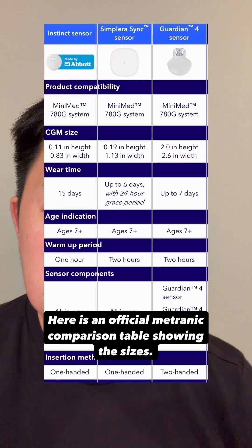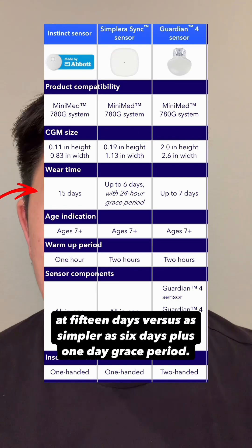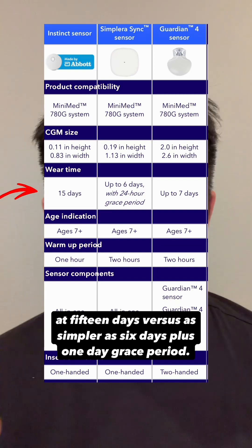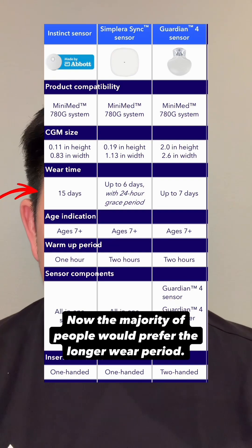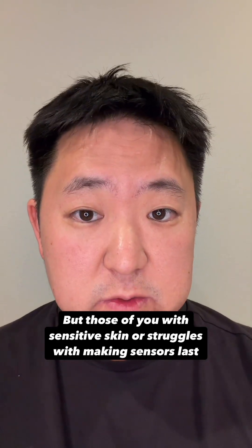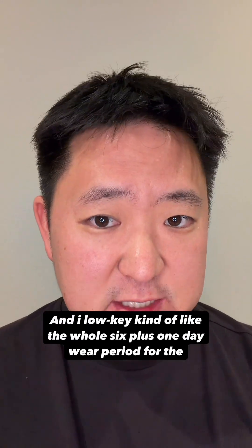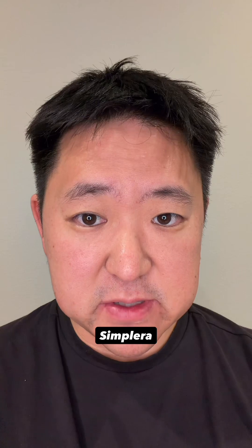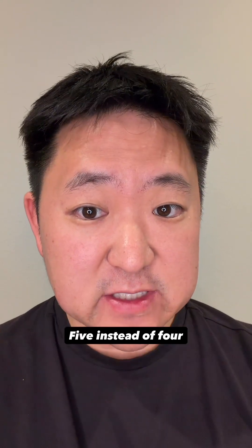Here is an official Medtronic comparison table showing the sizes. It also shows that the wear time for the Instinct is quite a bit longer at 15 days versus the Simplera's 6 days plus 1 day grace period. The majority of people would prefer the longer wear period, but those with sensitive skin or struggles with making sensors last the full time might prefer the shorter wear period. I kind of like the 6 plus 1 day wear period for the Simplera, because it actually allows people to receive one extra sensor per month — 5 instead of 4.